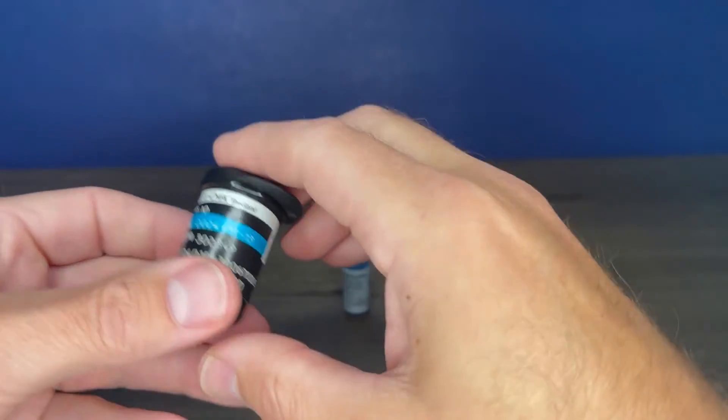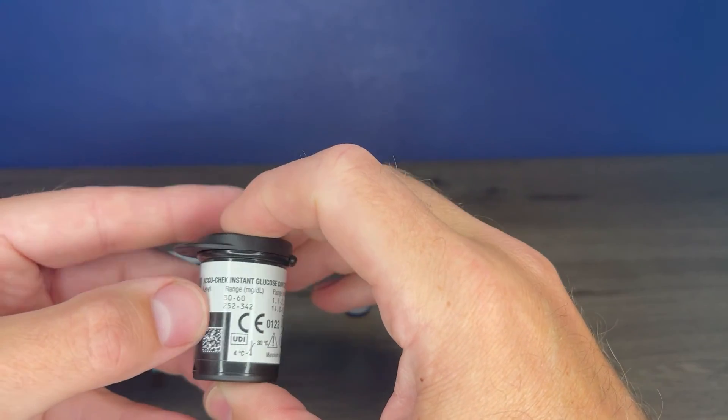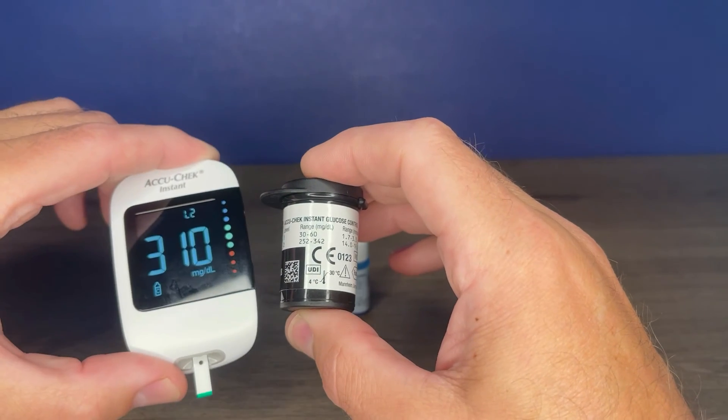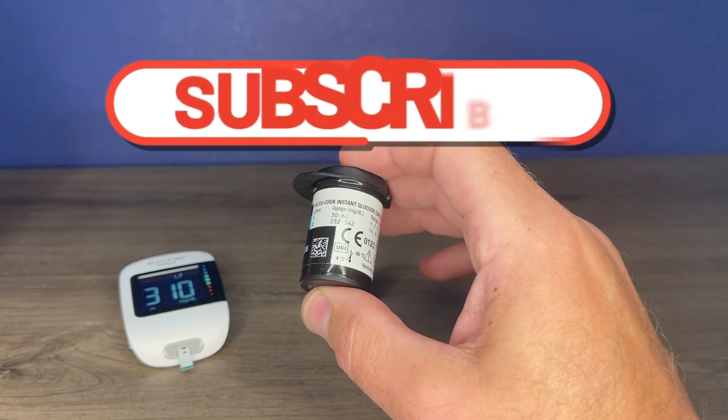You can also check the side of the test strips — right there. Level two should be between 252 and 342, and 310 is of course between that. That's letting you know that your meter and test strips are working properly.